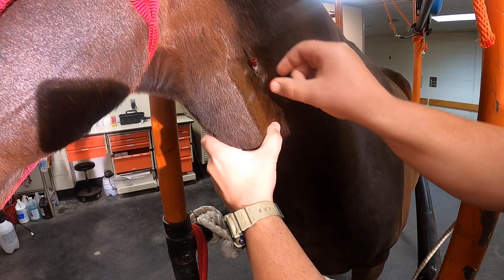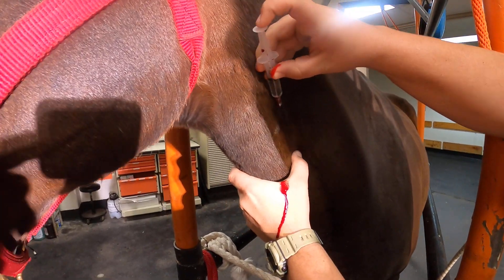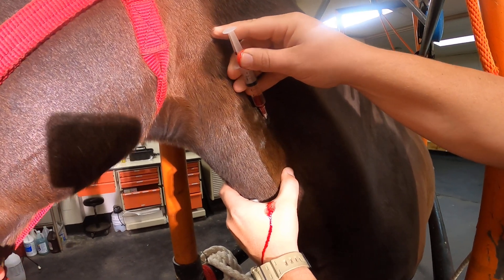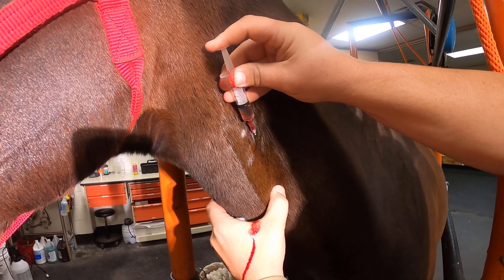Once we see blood coming into the hub, our syringe is hooked up with our medication into the needle and then it is pulled back. Make sure we get a flash — we see that, which tells us we are still in the vein — and then our medication is then injected.